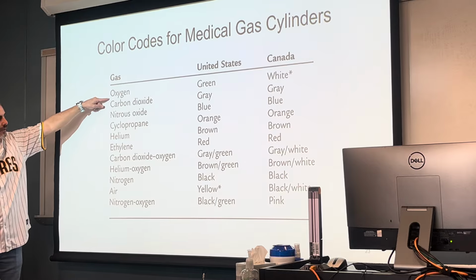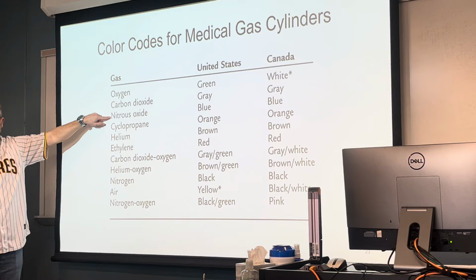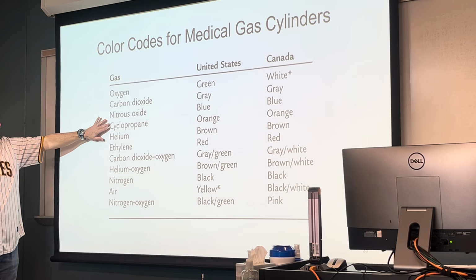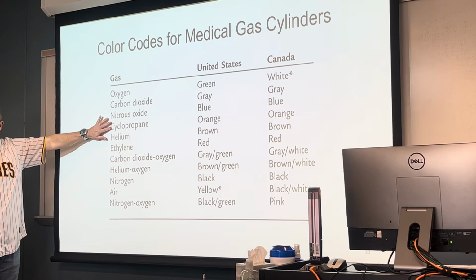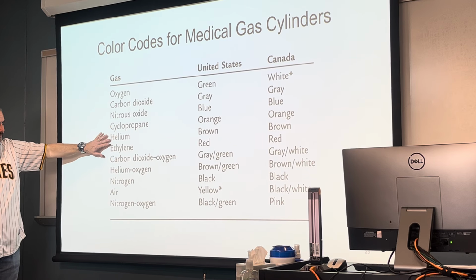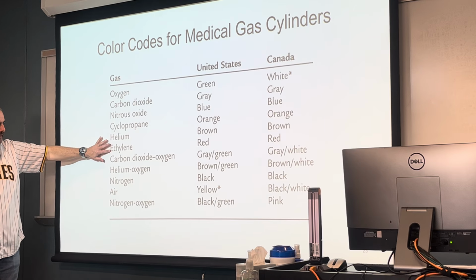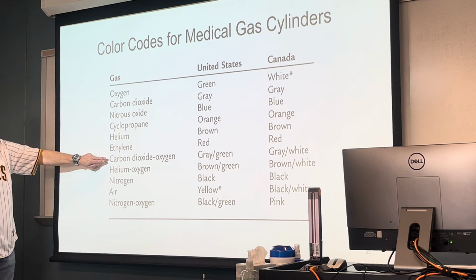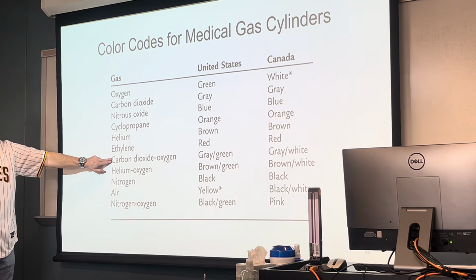So, other colors that you need to know: obviously oxygen, carbon dioxide, nitrous oxide. I'm not going to ask about cyclopropane; that's used for more anesthetic purposes. Helium I will ask. I won't ask about ethylene; that's used in sterilization.